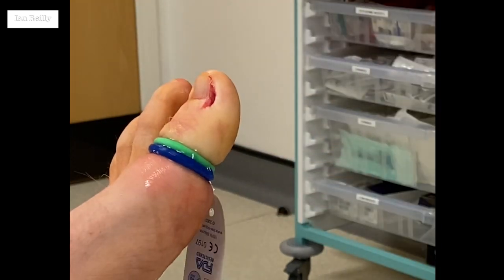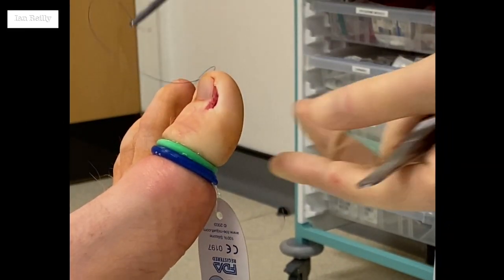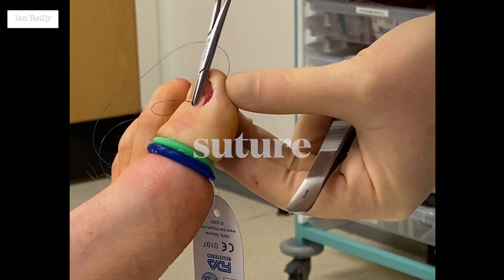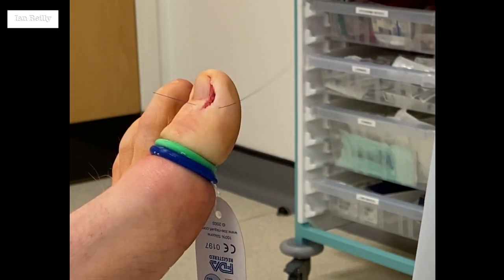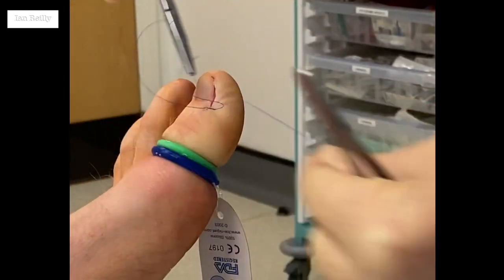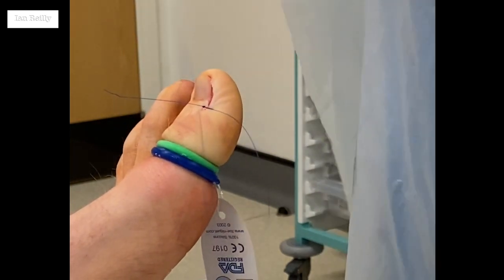So we'll just irrigate that out — it's an ideal solution to irrigate with. A 4-0 prolene. The reason we're using a 4-0 and not a 3-0 is because we don't have any 3-0 — 3-0 is a bit nicer. But Monica said to me, get over it, so I'm over it now. There's a new suturing technique you've not seen on the internet before.